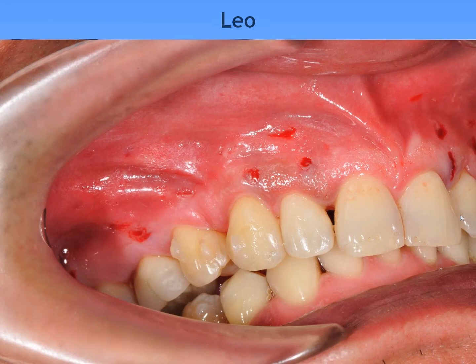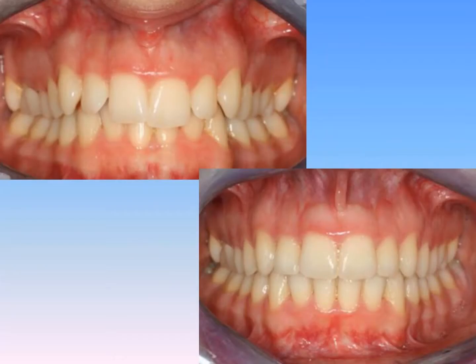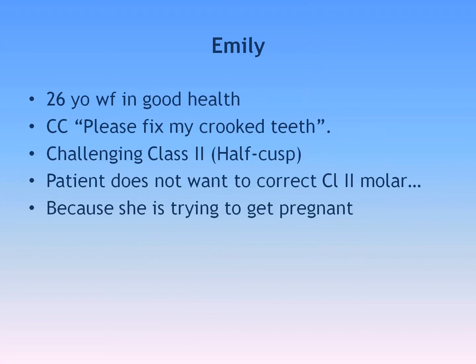You'll see that it completely heals up, but it was one of those things where, again, I was learning the technique, and I share these things with you so that you don't have to make those same types of mistakes. There he is with that little cut there. That's immediately after, before we've even really wiped it down. You're able to take people from a crooked position to a straight position really, really quickly, and we'll look at a couple cases with Invisalign where we did that.